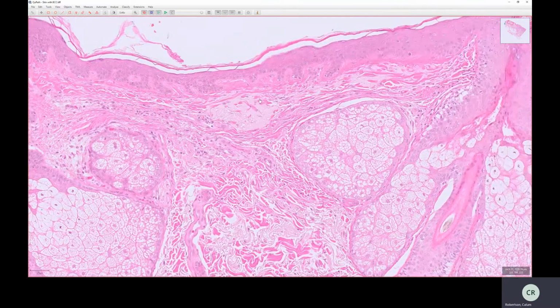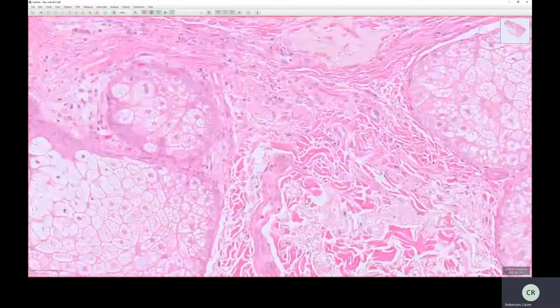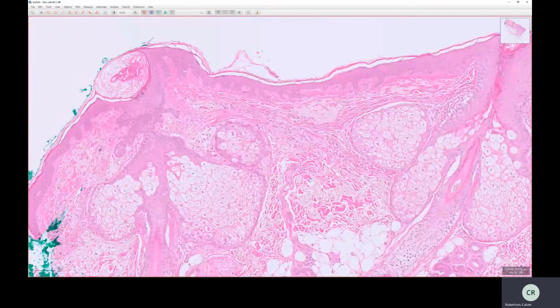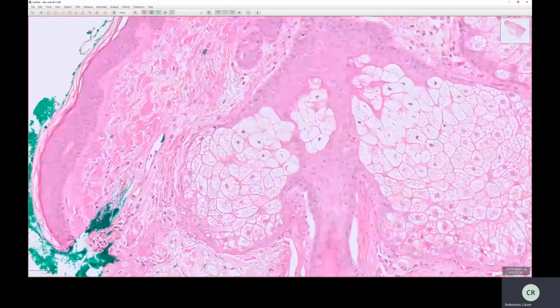The nature of the collagen and elastin fibers tends to be a bit finer in the papillary dermis, whereas these big blocky collagen fibers you tend to just see in the reticular dermis for the most part. The other way you can tell apart is there's a superficial vascular plexus. So here's a blood vessel running along.